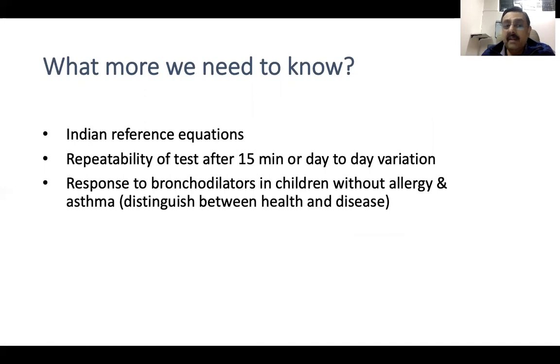We do not have any reference equations for Indians at the moment. We do not have very clear data even on reversibility or the repeatability of the test: if you do it now, if you do it after 6 hours, if you do it after 2 days in the same child, how much variation is acceptable? Is it like 5% or 10% or 15%? That is something which we don't know.